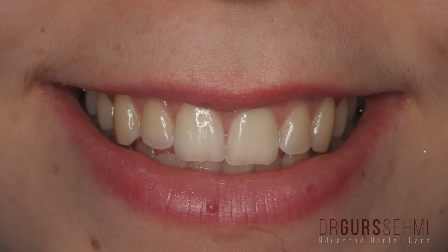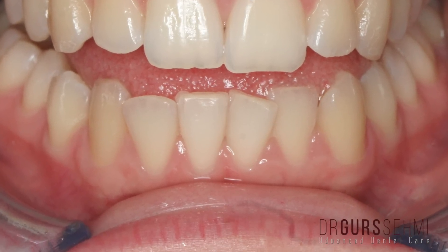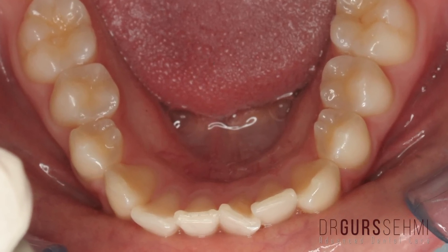This is Cordelia, and Cordelia came to me because she wanted her bottom teeth straightened out. She didn't want anything to do with the top ones — she was completely happy with those — and she wanted quick, easy and cheap. Oh, and completely invisible. So we only really had one option and that was to use a lingual brace like the one shown in this photo.